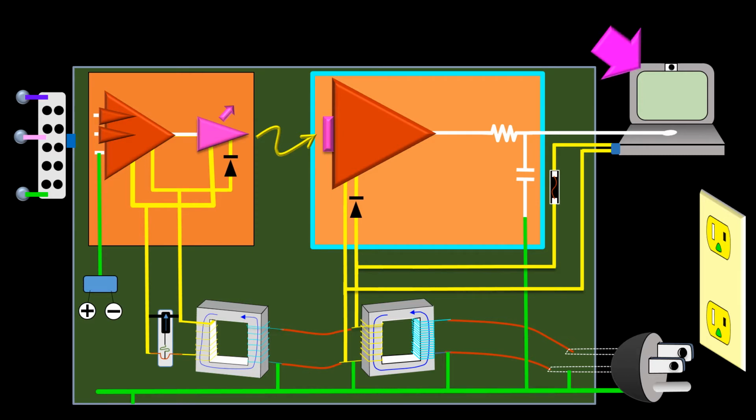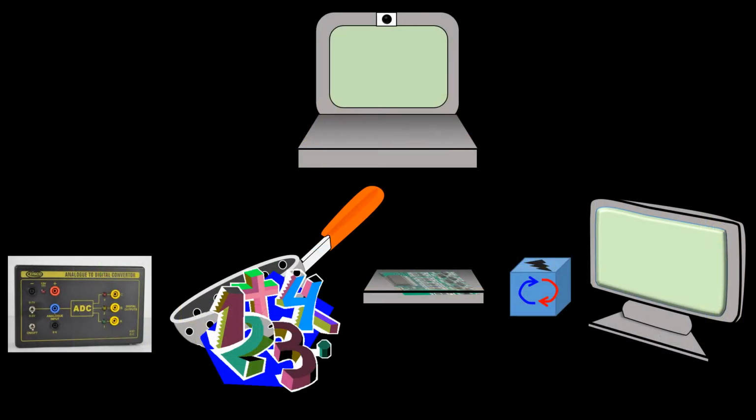But what really makes the evoked potential machine significantly different from an EEG machine is the computer. The computer, in addition to having an ADC converter, numerical low and high frequency filters, a discrete to continuous converter, and a screen, also has an internal mechanism that triggers a stimulus and matches time with the stimulus in order to acquire data in a relatively small time period that would allow us to accumulate that data and summate it.